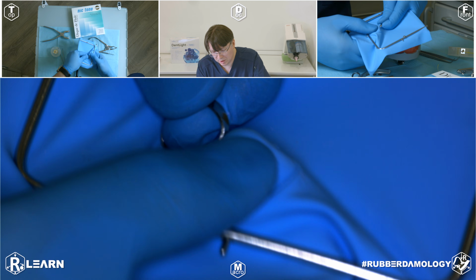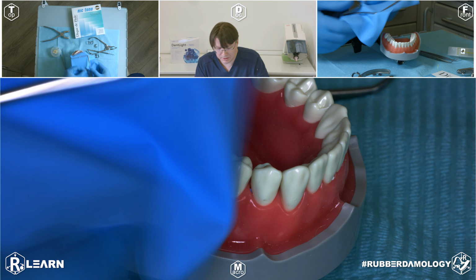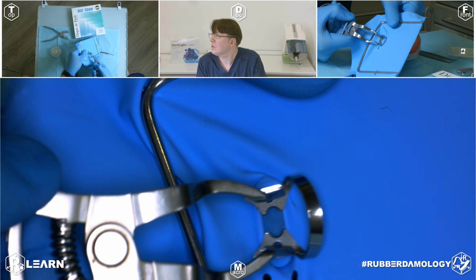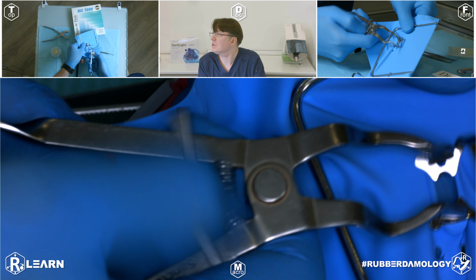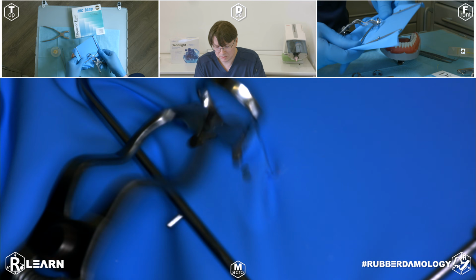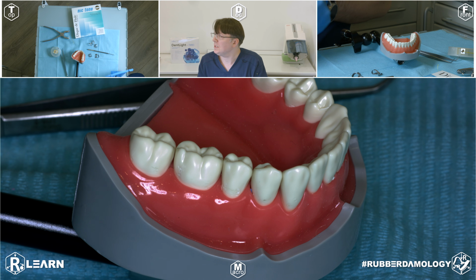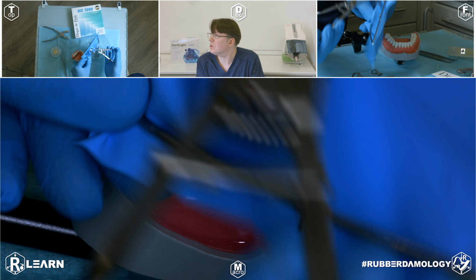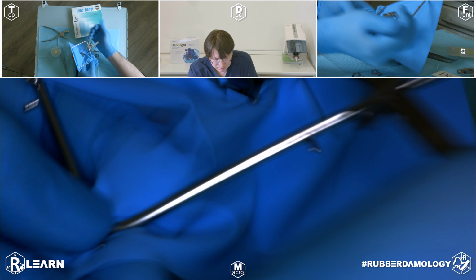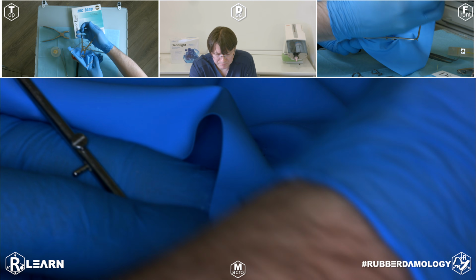Stretch the perforation and put it over two wings. Two wings from one side, two wings from the other side. Fix your clamp pillar. Adjustment to the stopper. So you can release your hand. Release the bottom angles of your rubber dam from the frame and put your rubber dam over tooth number 45.